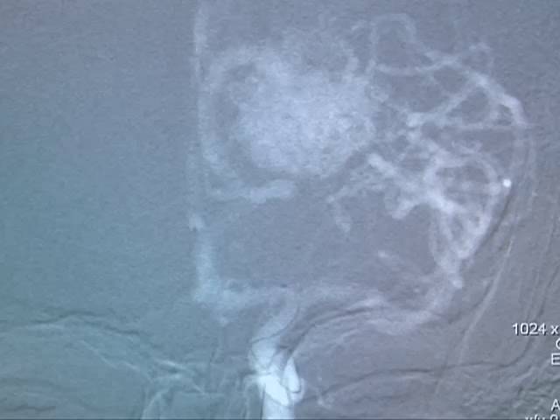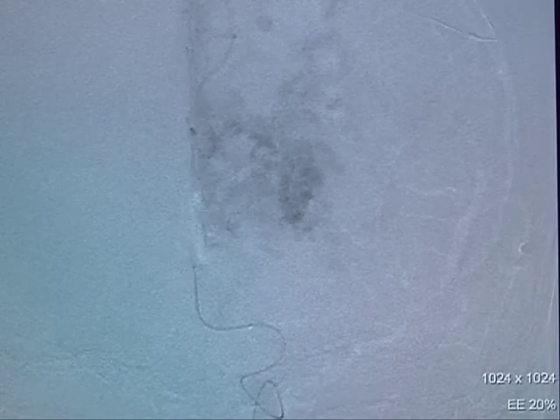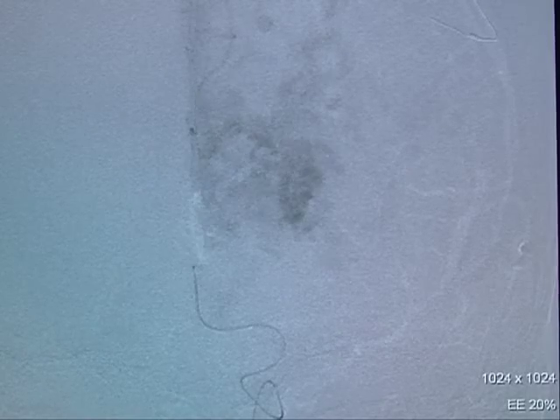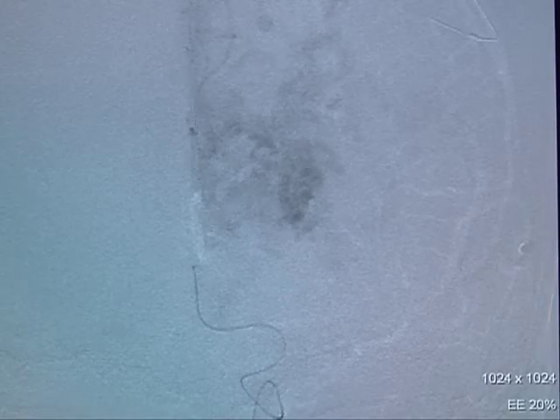Once the catheter is in position, we will do an arteriographic run through the catheter to see if any normal brain is opacifying along with the AVM. We then will inject a medication — lidocaine or amytol — to see whether or not there are any neurologic deficits in the patient. If there are no neurologic deficits, we will continue with the embolization by injecting Onyx-18 into the feeding vessels and the AVM.